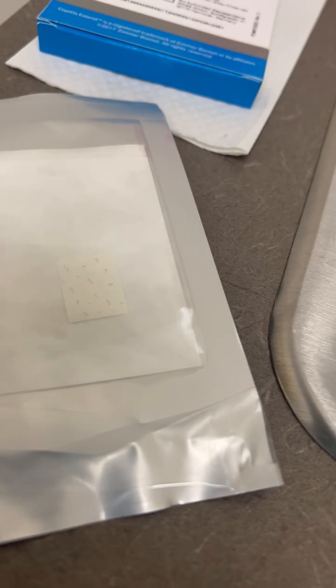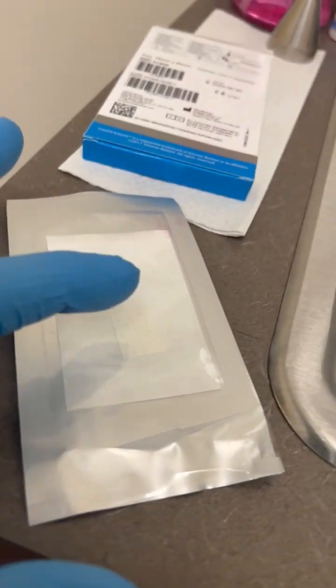You can see what the membrane looks like right here. I don't use the whole thing. I only cut what I need and put back in the package.